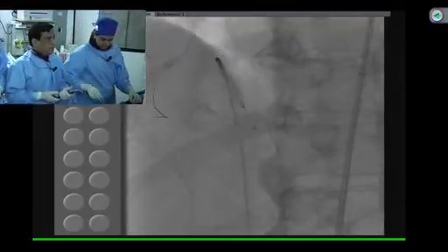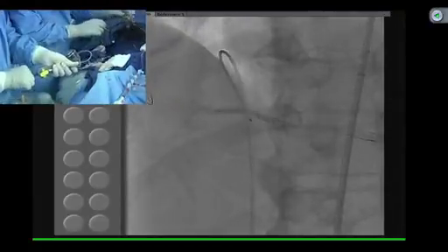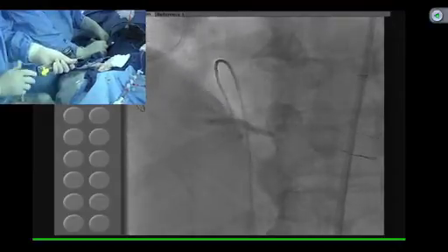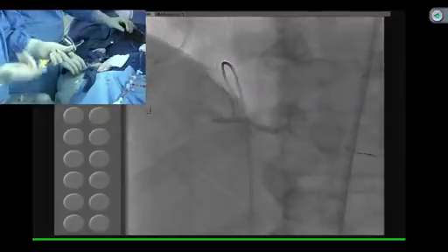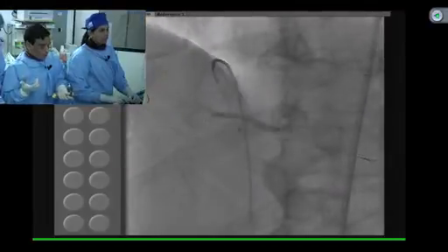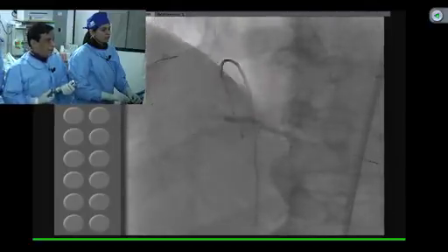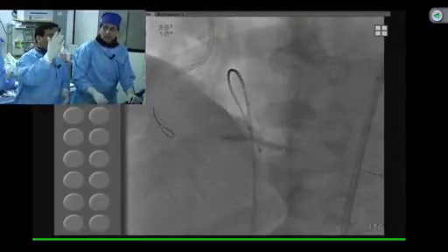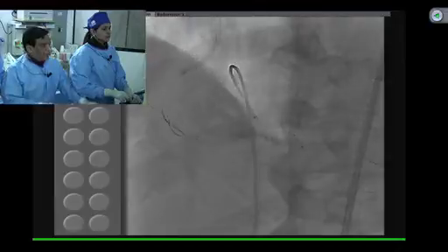Good. So now we can go 20 atmosphere here. You are protected within the confines of the stents. Right, exactly. So there is no need to bring back a high pressure balloon dilatation, although there is one trial that did say that taking a 20 atmosphere of the compliant balloon versus non-compliant gives you a different lumen based on the IVUS and maybe a trend towards lower restenosis. But if angiographically and with your stent boost things look good, to me, I think it's fully expanded, and that's completely fine.